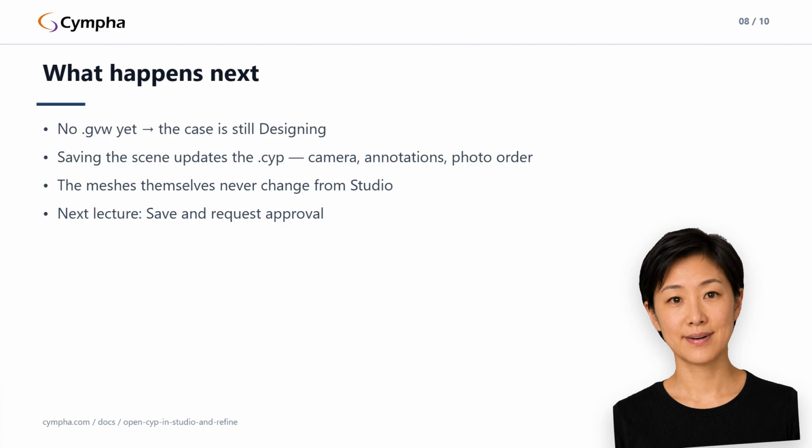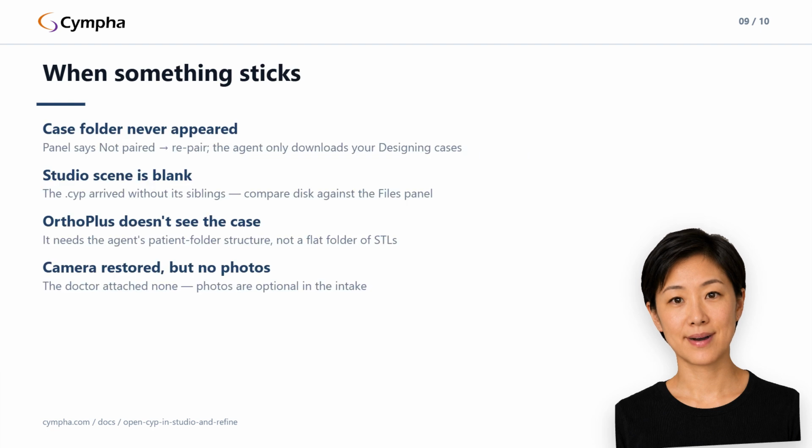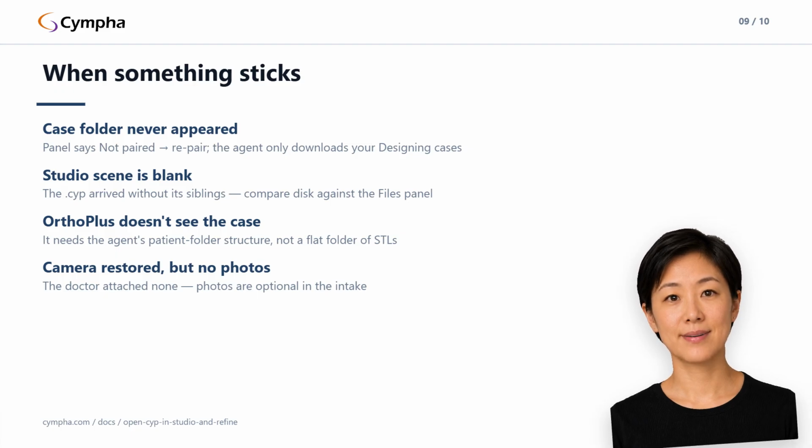Studio opens but the scene is blank. The project file travels with a sibling asset folder, and if the scans didn't download alongside it, the scene comes up empty. Check that every file listed in the case's files panel is actually on disk, and look for download errors in the panel. OrthoPlus doesn't see the case.